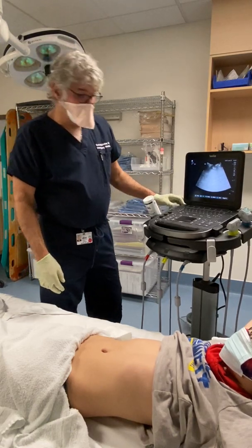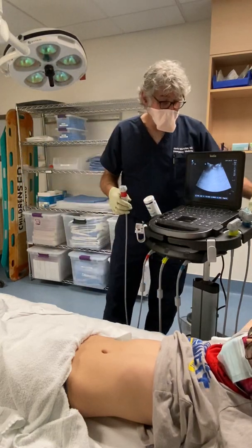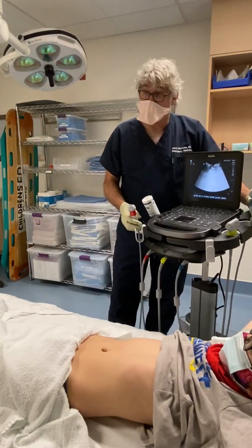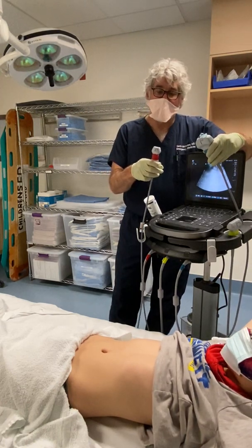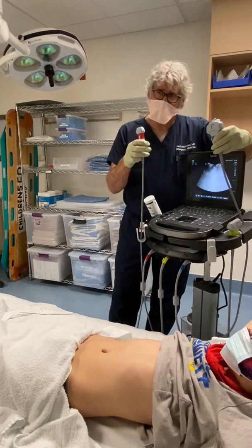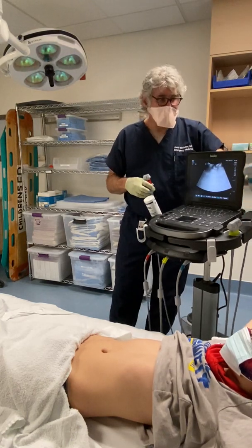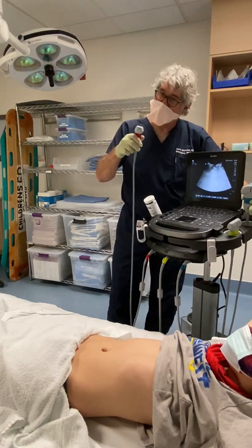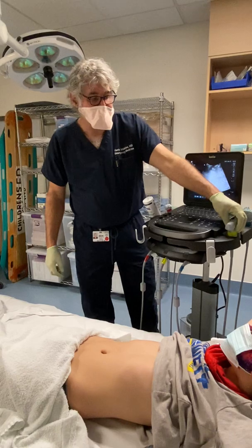Both of them have three different probes, and as you start doing more ultrasounding as nurses in our department, you'll be dealing with three main probes. There are two low-frequency probes, which can see really deep but have very poor resolution. They're still very important probes that you'll use most of the time. There's your curvilinear probe and your phased array probe.